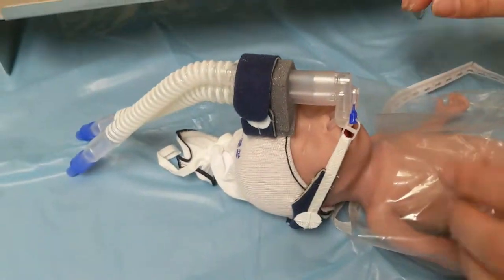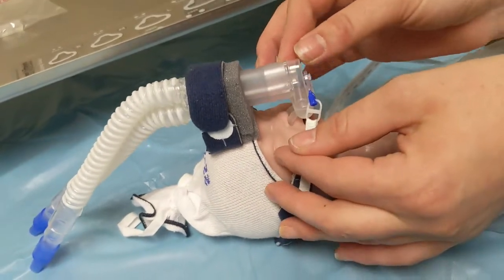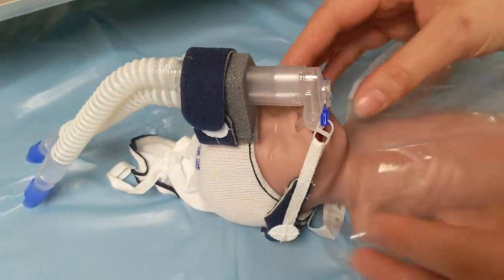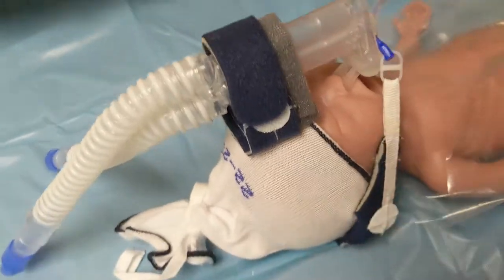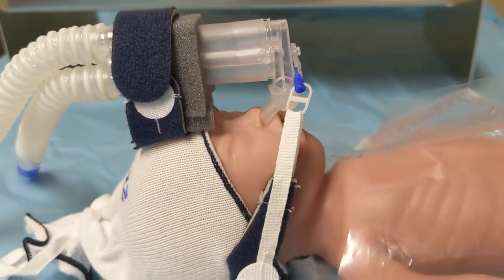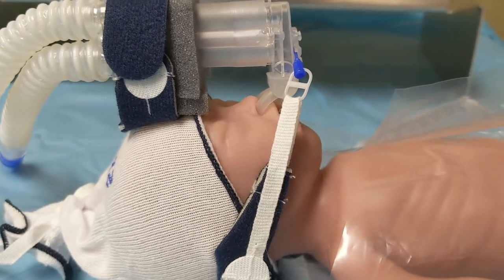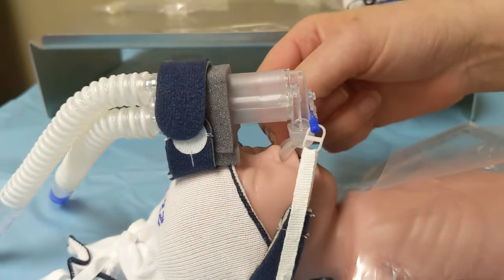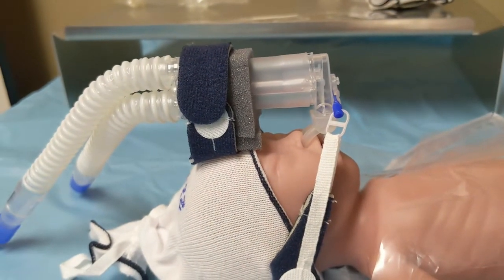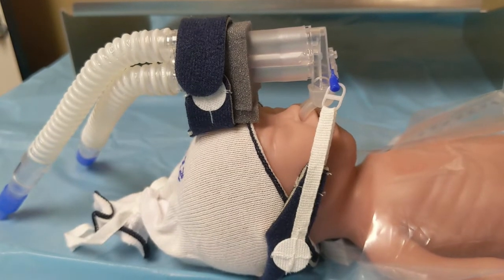And there we have it. If you simultaneously tighten, that helps relieve a common issue where it gets pulled over to one side. We can see that our prongs are well off our septum, because they actually cannot go farther deeper into the nares. That's because they're occluding at the base here, which is what we want, because for CPAP to work, we have to have a good seal. That's why it needs to be occlusive.